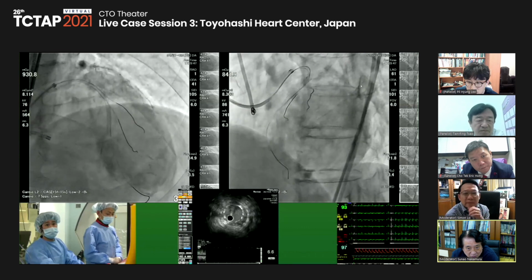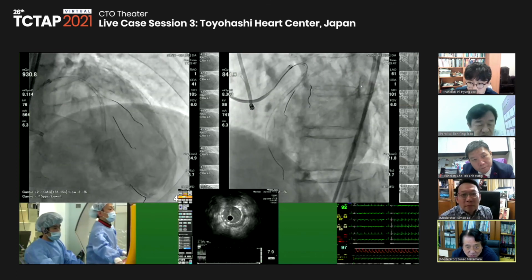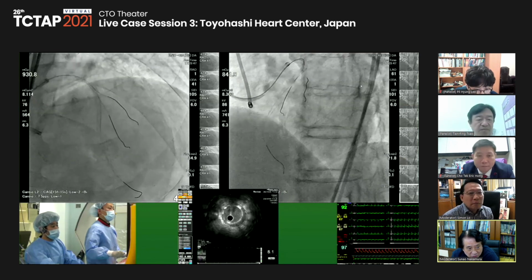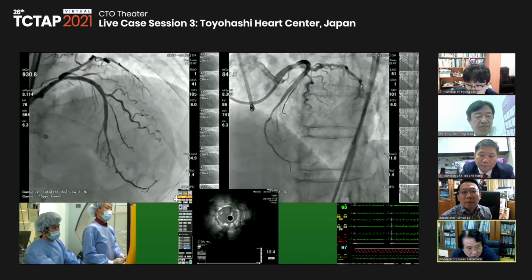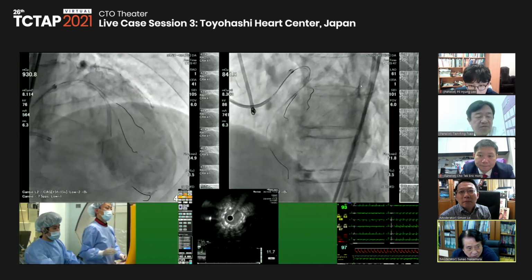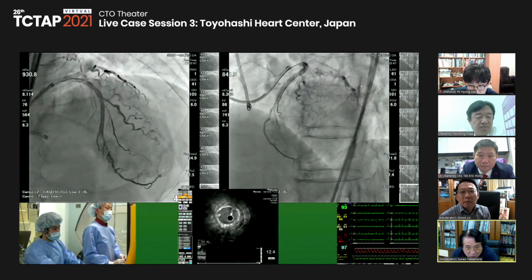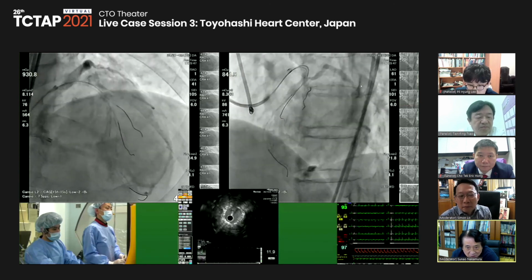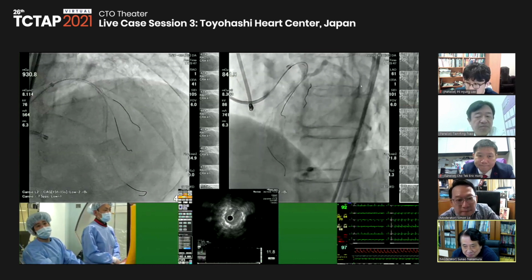Maybe 50% of CTOs have a bifurcation lesion, so we should select the appropriate one. Today he showed a very elegant single stenting and balloon protecting way. This is very educational. Thank you very much.